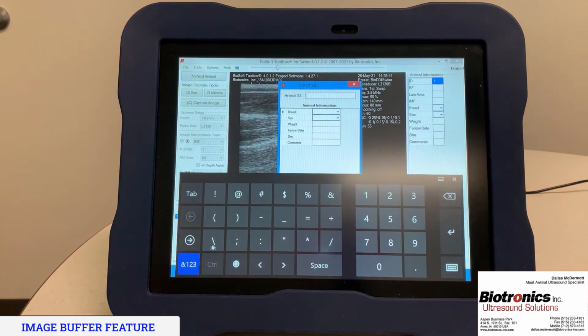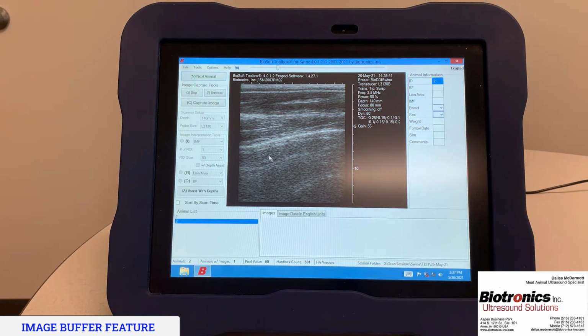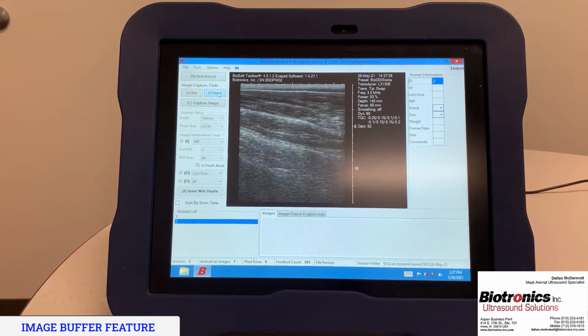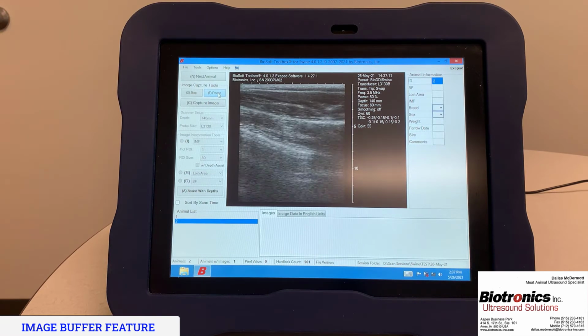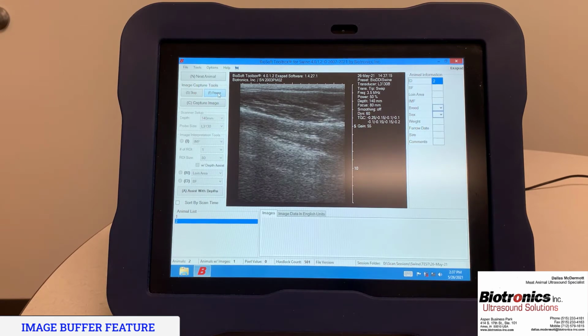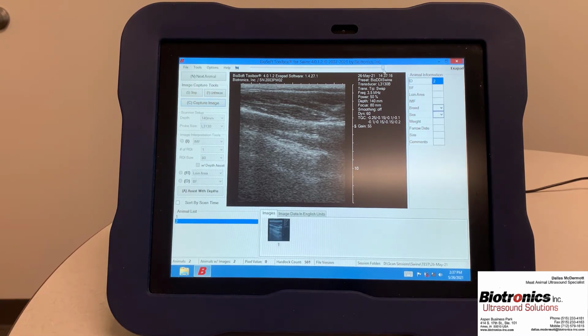And as you watch, I'm just going to do that process again and go to number 2 and enter that, and we're going to start scanning again. But on IMF, you can just let that buffer go the full 8-9 seconds, and then just go back and select the images you want to capture, the independent images. There is no compression in these images, so they work very well for going back and doing your interpretations later, or at present if that's what you prefer to do.